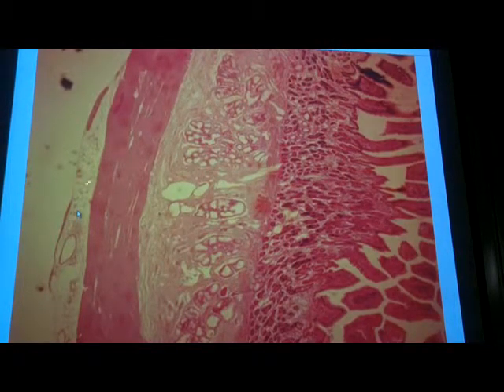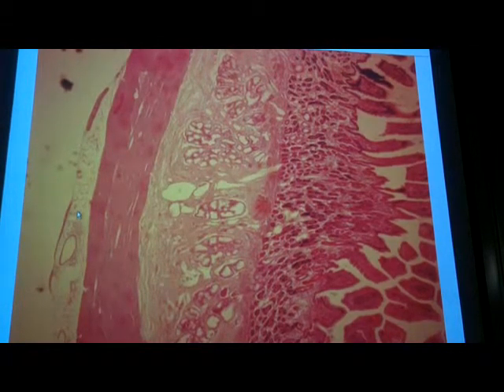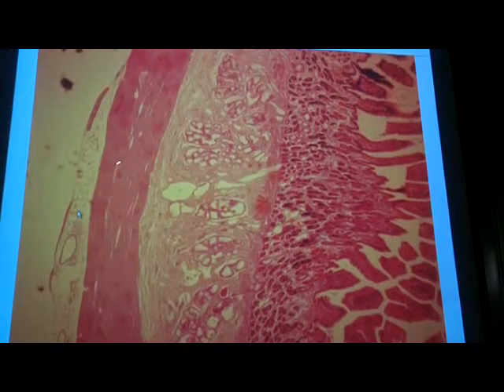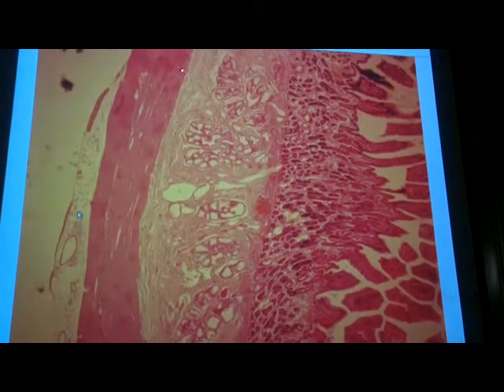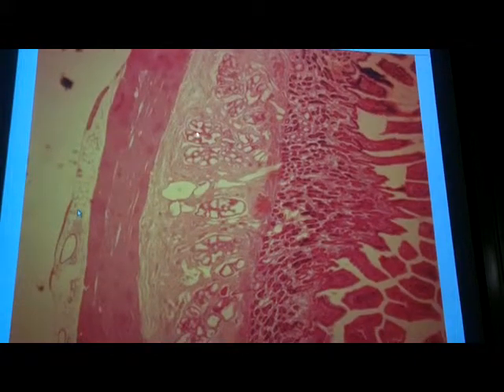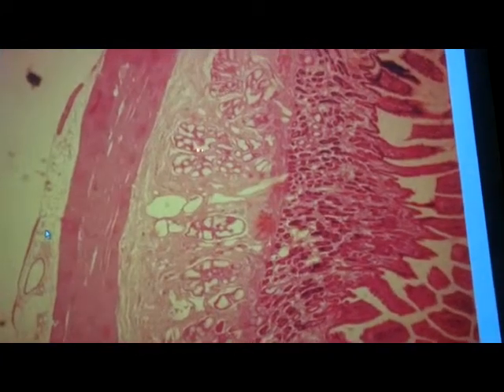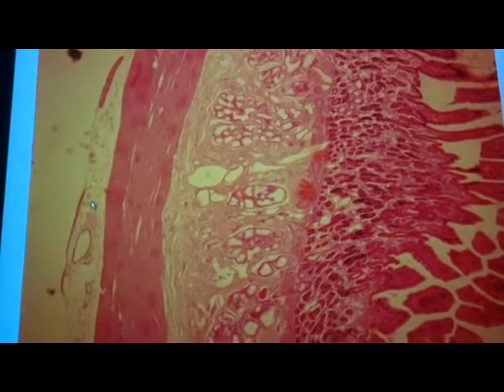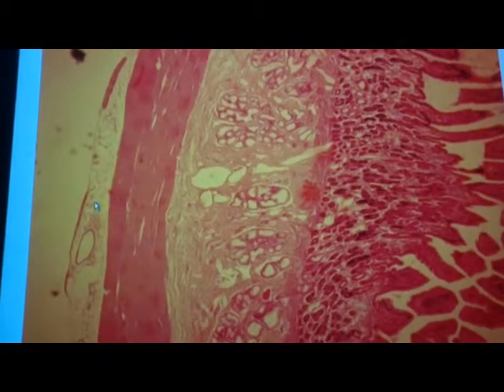This slide actually shows the serosa pretty well. And do you see 2 layers of muscularis externa? There's one, nice, bright, smooth pink. But here's the submucosa, and all that stuff, those are the glands. Those are the Brunner's glands that secrete an alkaline mucus to keep you from getting an ulcer there. What comes next after duodenum?